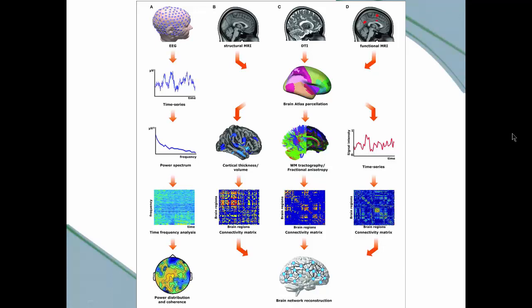These are three non-intrusive methods of brain imaging, so to speak. The EEG is the least expensive. Now you see this figure here with this cap on. That's an overkill as far as the number of electrodes that are on the person.